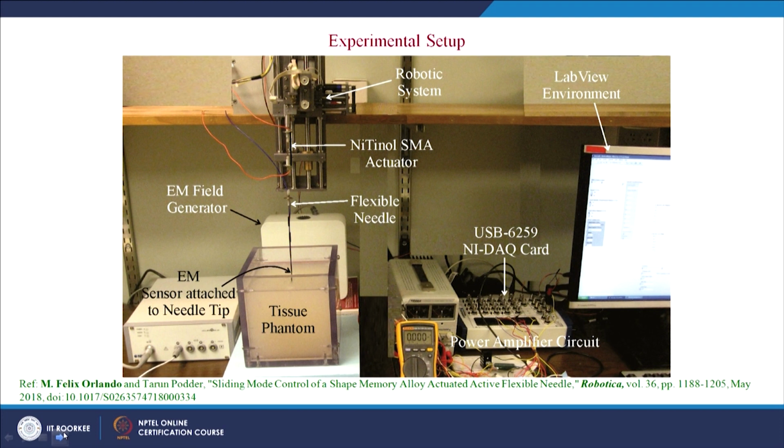So, the experimental setup is the one where we can see the sensory system, the EM tracking system, and the EM sensor attached to the needle tip. The tissue phantom is shown here, which is an artificial tissue, and here is the robotic system.